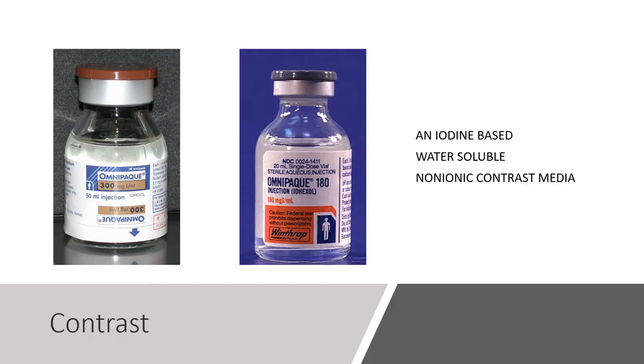For contrast, we're going to use an iodine-based, water-soluble, non-ionic contrast. An example here is Omnipaque 300 and Omnipaque 180.